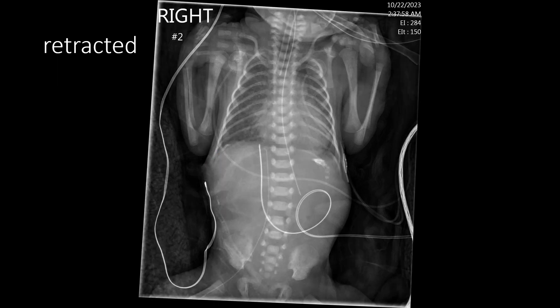Here they've retracted the catheter. We see it coursing from the right extremity to the right of midline in the IVC and terminating right at the diaphragm — so nicely positioned. Now that they have that PICC line in place, they will likely go ahead and remove the umbilical venous catheter since they have good central access through the peripherally inserted central venous catheter, which can be in place for up to three months assuming no complications.